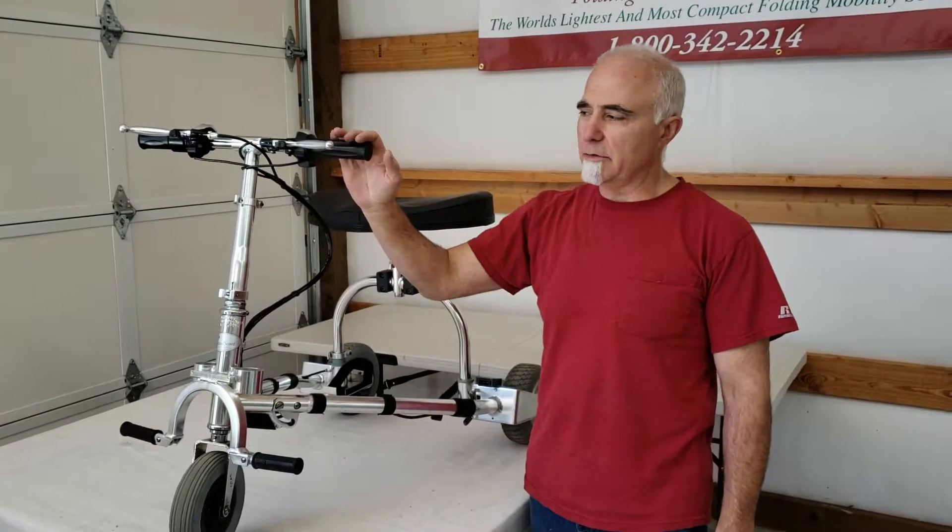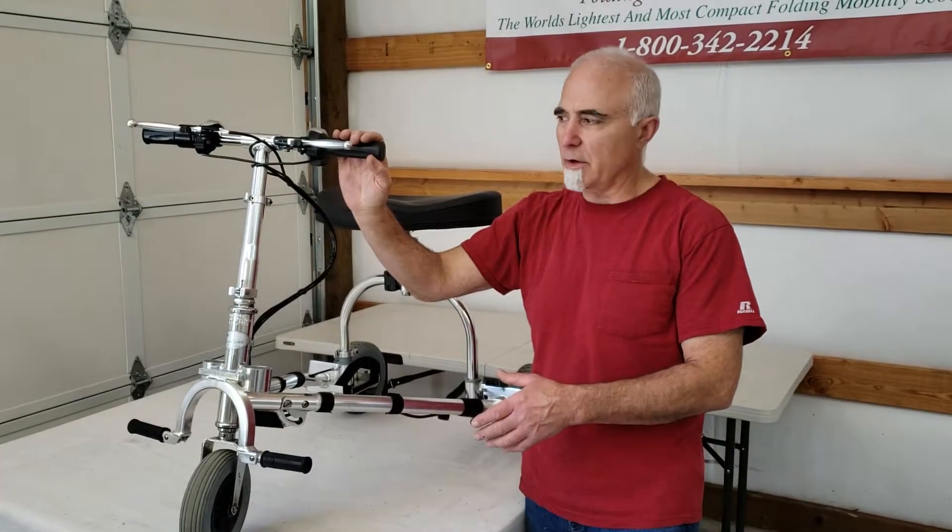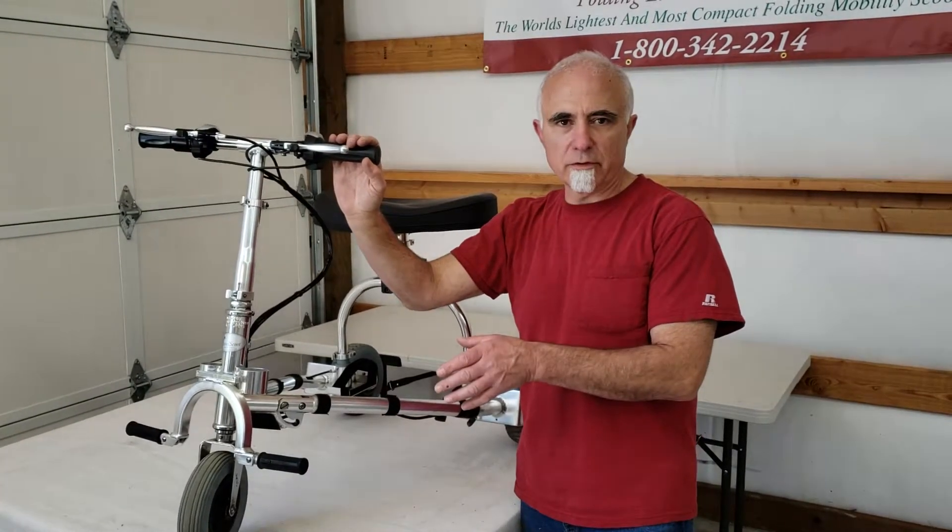Hi folks, this is Tony at TravelScoot again. Today I'm going to show you how to set the parking brake on the later model TravelScoots with the direct drive. It's simple enough, but we get the question frequently.